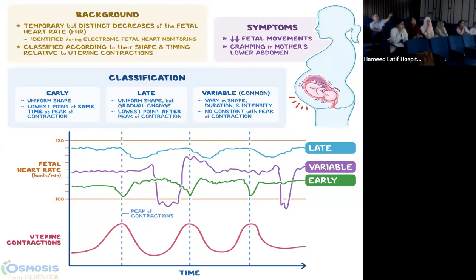So in early, why do you think it happened? I just want you to remember 2 to 3 words about whatever is going on. So, cord compression. Take it. Next, head compression. Descent of the head can cause an early decel. That is the hypothesis. I'm not saying that this was written in the Quran or something. This is what they think happens. They can be wrong. ठीक है जी? Next पे, तुम्हारी slide बड़ी अच्छी है. Well done. It's a good slide. Actually, I was trying to find it, but then I'm very bad.